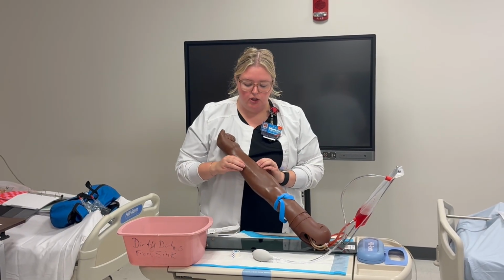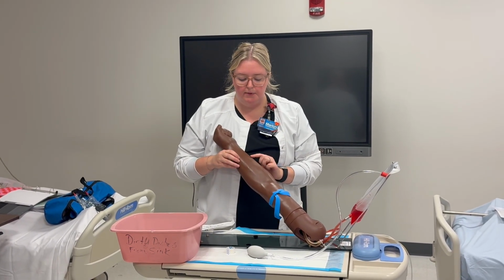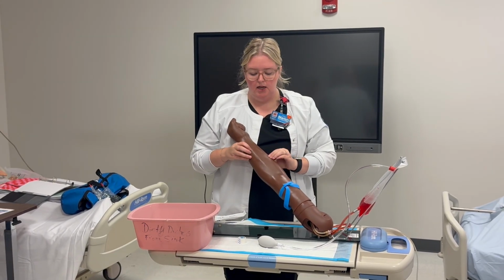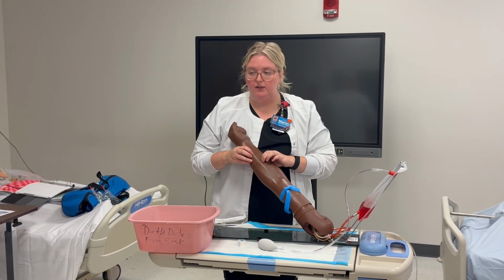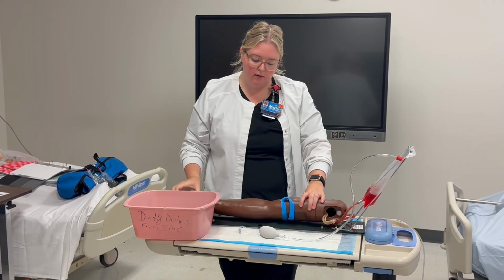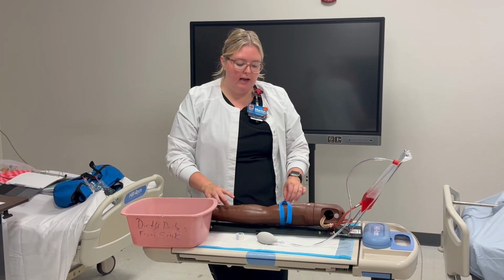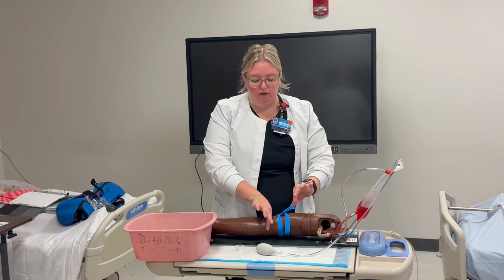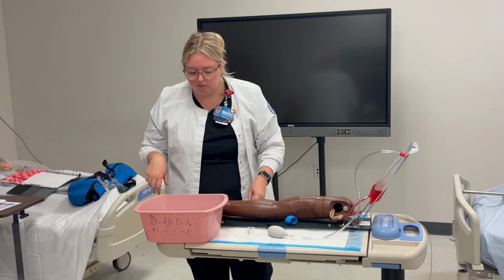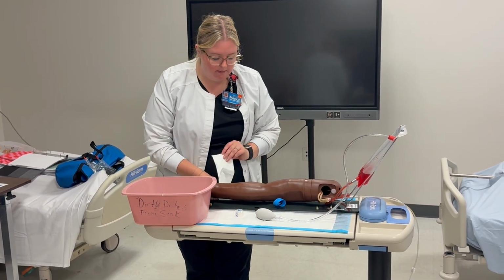Okay. The way that these are set up is there's a little tube that sits down in a little crevice inside here, so it does kind of feel like a bounce. If it's really hard, that's the plastic, you don't want to stick there. All right, I'm palpating, found my vein. Take the tourniquet off. Leave it there. And then I'm going to get the rest of my stuff set up here.